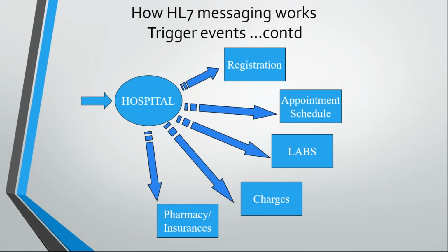See, so the basic logic remains same, how we implement and how to create an HL7 message. Extract the data from database and you go ahead and construct the HL7 message using transformations. Even in Ensemble, we'll have transformations. Usually interfaces on Ensemble are called as productions, and we'll be able to build some transformations in Ensemble.